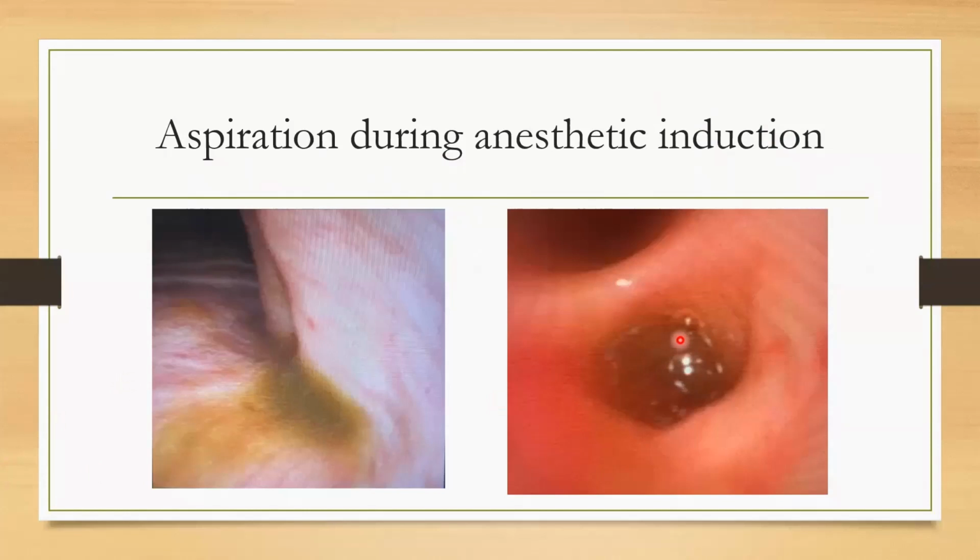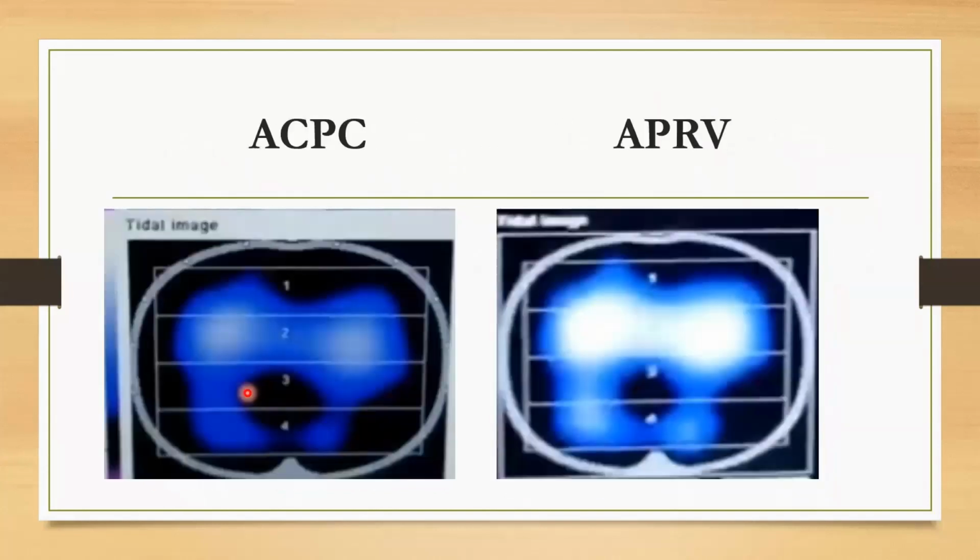So they called me into the recovery room because the patient was going to be admitted into the intensive care unit. The FiO2 was at 100. We were satting about 89, 90, having trouble oxygenating. Over here, you see that the majority of the ventilation is in the ventral and mid-ventral areas. You can see this left dorsal area is the most affected, but you can see this is not a normal distribution of ventilation.